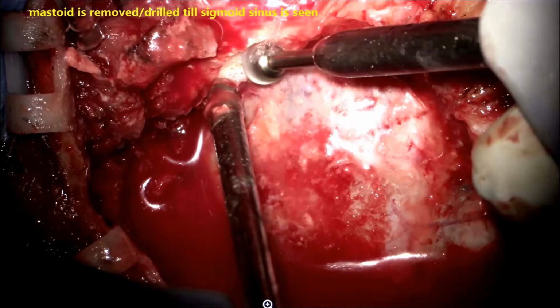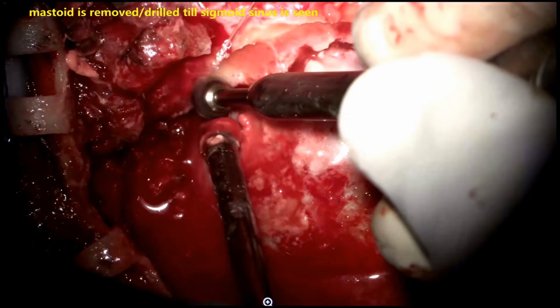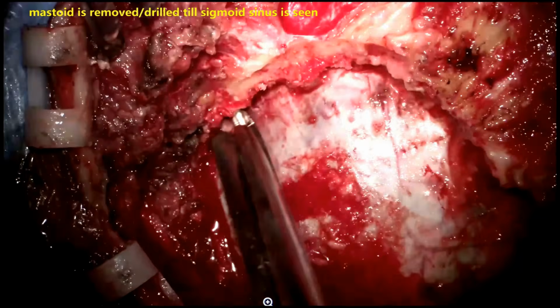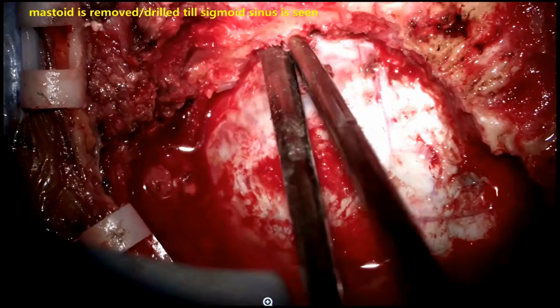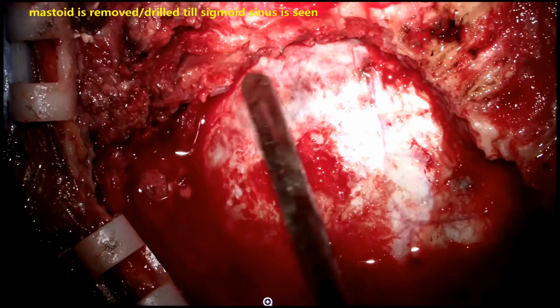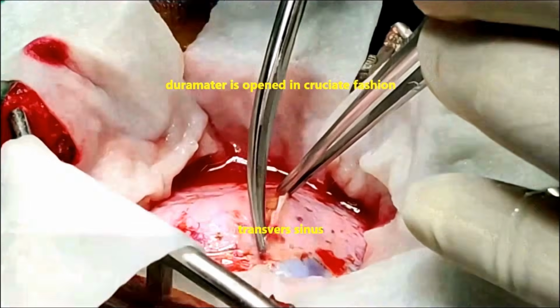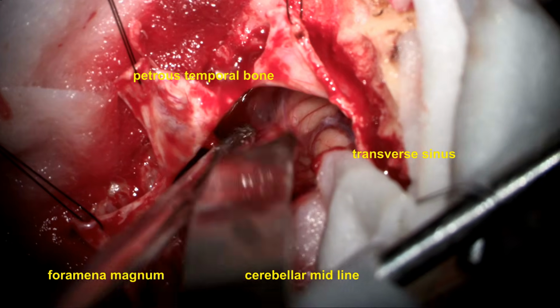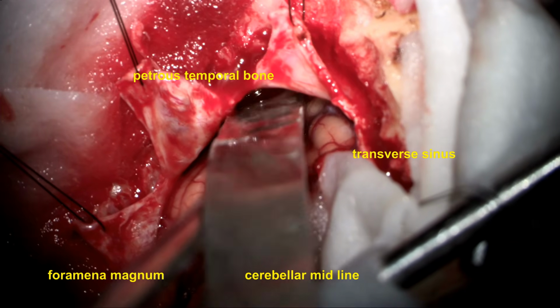Sometimes the mastoid air cells get exposed. We need to close these mastoid air cells. Superiorly, the craniotomy goes up to the transverse sinus. That's very mandatory to expose to have a comfortable, smooth, and safe excision of posterior fossa or lateral cerebello-brainstem space lesions.